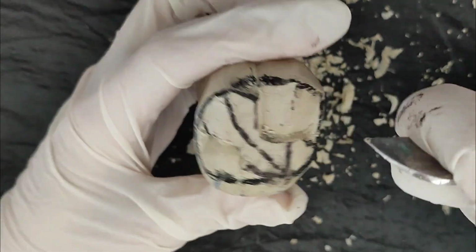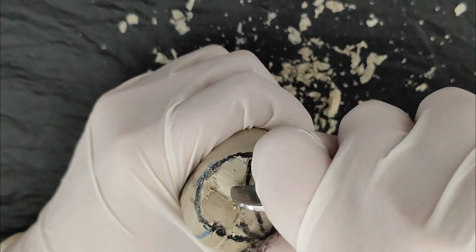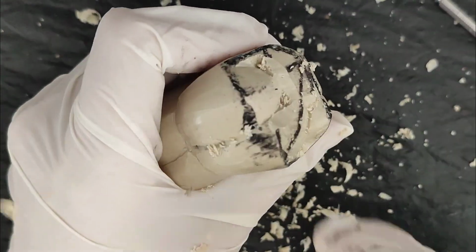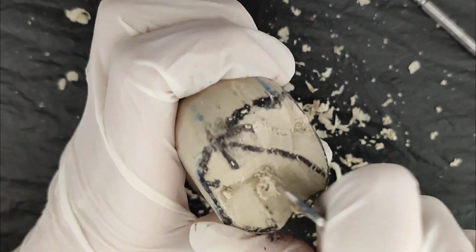Then we move on to the rounding of the oblique ridge, the mesiolingual and distobuccal cusp together. Start with the mesiodistal direction and respect the direction of the two cusps that form an open angle on the mesial side.